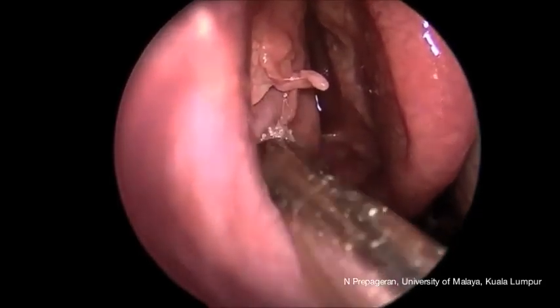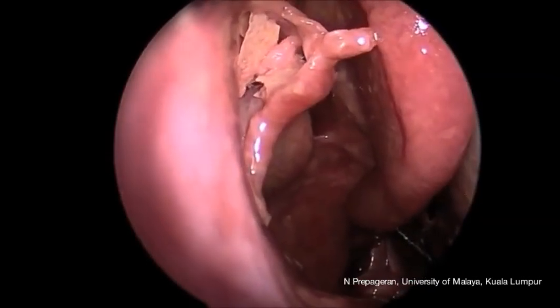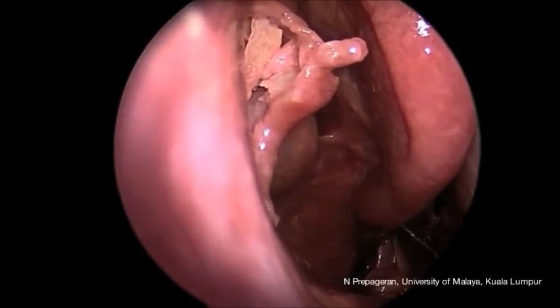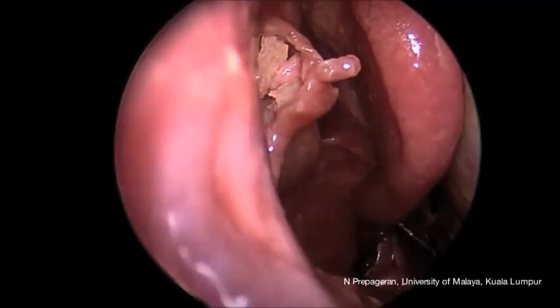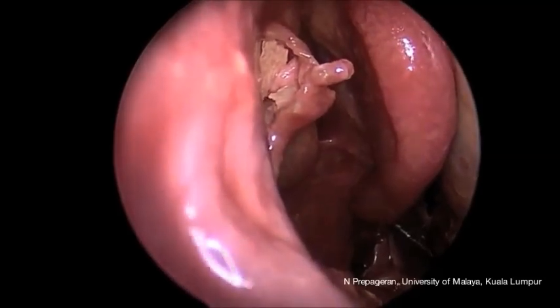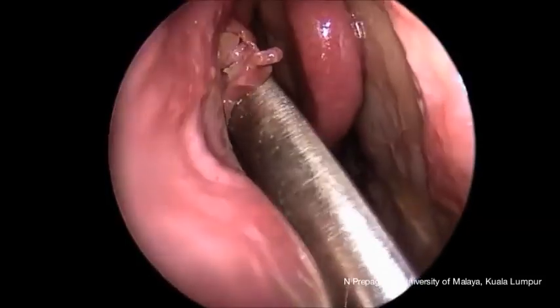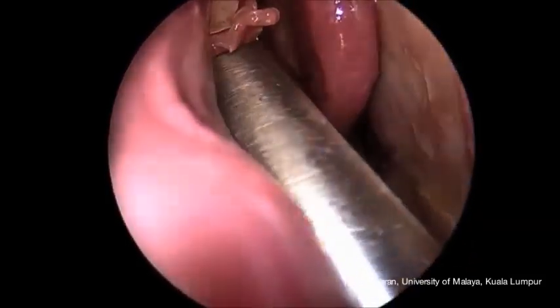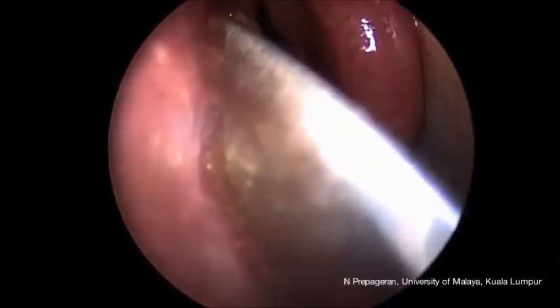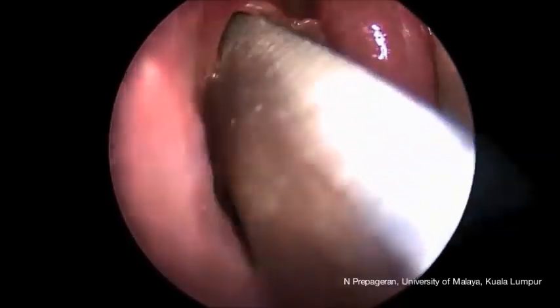Subsequently, you can remove the remaining part of the uncinate process, and in this case, because the bone has been removed previously, there's only the mucosa of the sac, or blind sac, of the uncinate process left, which we are going to remove now by using a forceps later. So let's appreciate the anatomy again. That is the uncinate process blind sac. We are going to dissect it all the way to the top.